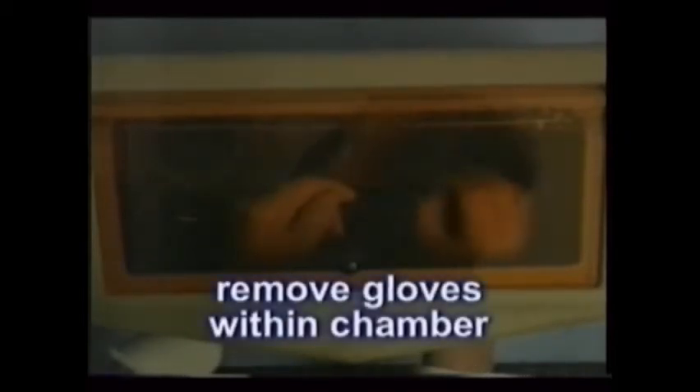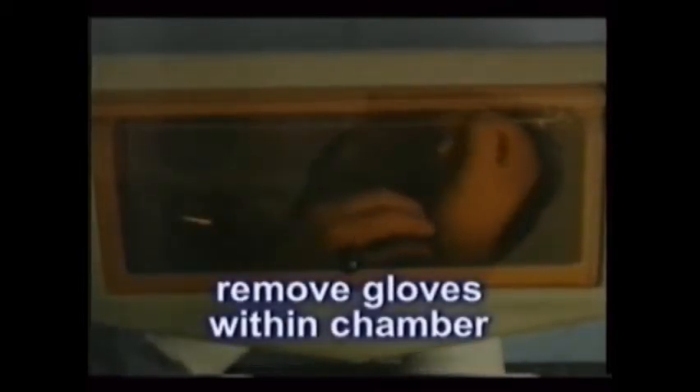When done, take the gloves off while still in the chamber. Remove your hands, and then open the top. If the waste must be removed, use a paper towel or another set of gloves.